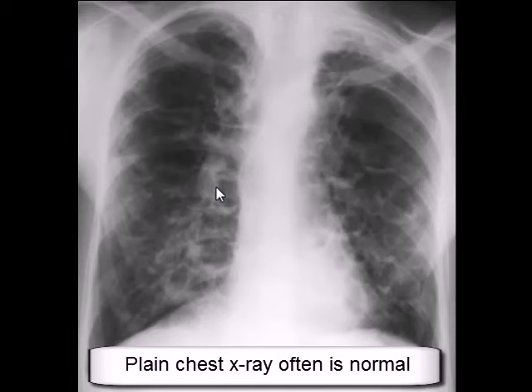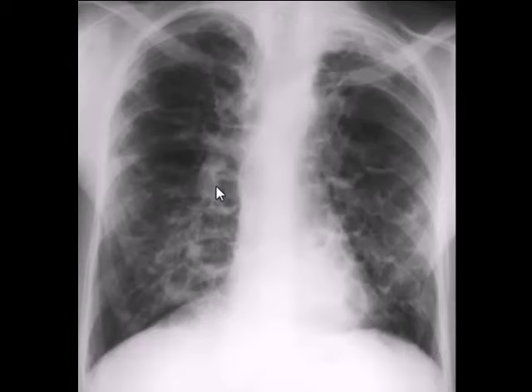Very frequently bronchiectasis cannot be seen on chest X-ray, and investigation of choice is high resolution CT scan of chest or HRCT. And as you know, CT is a cross-sectional imaging anyway, and the sensitivity is much better than plain X-rays in any case.